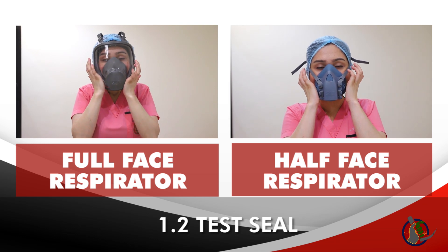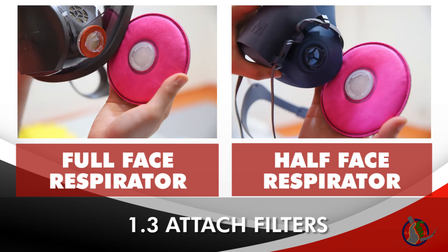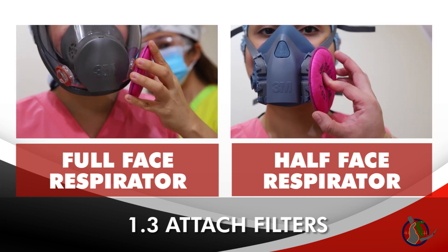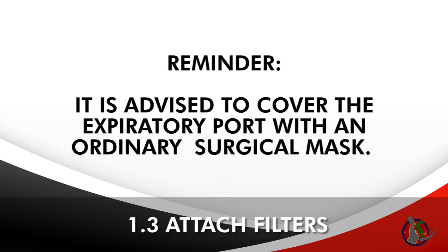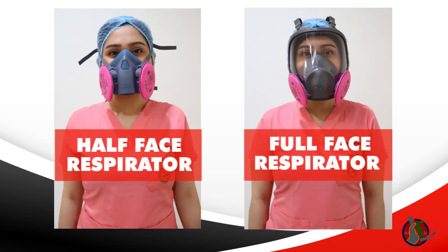The buddy attaches the filter onto the air inlet by twisting the filter clockwise until it locks into place. It is advised to cover the expiratory port with an ordinary surgical mask. You have now donned your respirator.